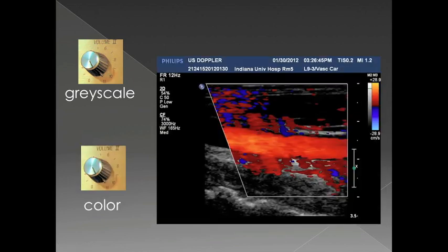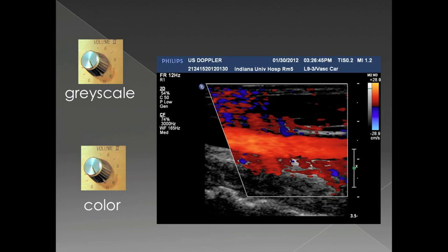Each portion of the ultrasound image — whether it's the grayscale or the color Doppler — has its own gain that can be set independently. This is an image of the carotid artery, and you can see the artery running through here, but there's also color Doppler signal posterior to the carotid artery and within the near field. All of this is noise because the color Doppler gain is turned up too high.